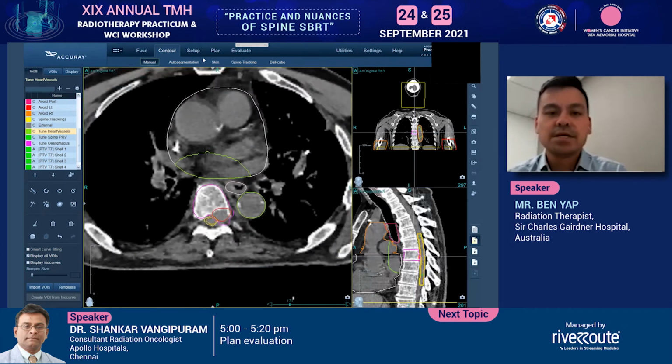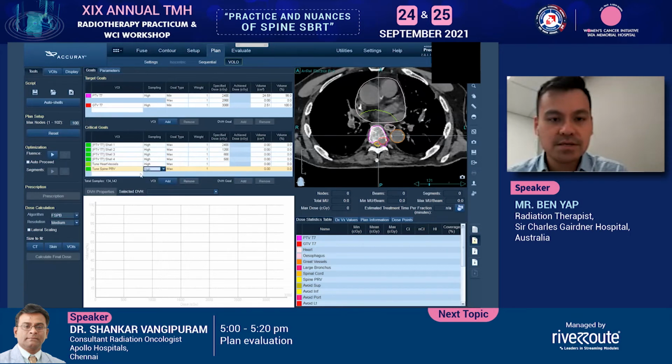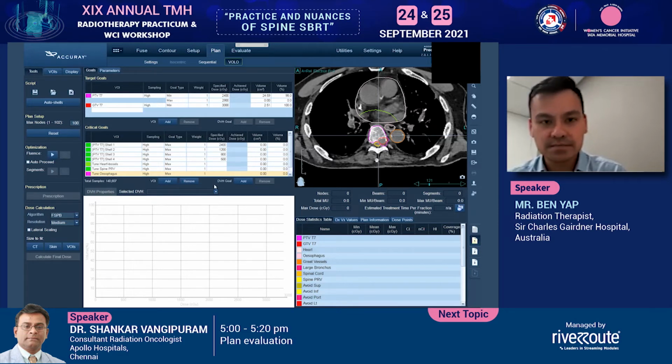field. All right, so with that, let's put those same goals in now. That, and the spine, and the esophagus. And now from 600,000, I've dropped to 140,000. So what does that mean? That means that every iteration, or every time I hit play, it'll be faster. It means that I can hit play more times. That means I can always improve instead of waiting for each iteration to take forever.